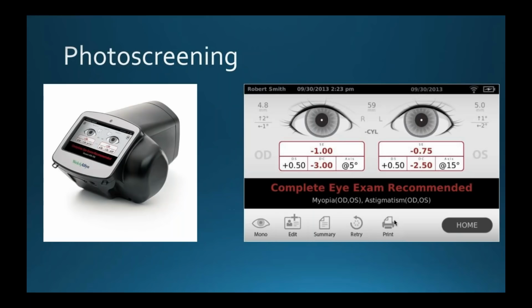And so vision screening and photo screening really achieves many of the goals that the World Health Organization has talked about. The health problem of decreased vision, and especially in preschool age children, amblyopia, with serious consequences, can be detected quickly and easily using screening methods, and we can treat the diseases or the issues that the children have that are causing decreased vision very well.